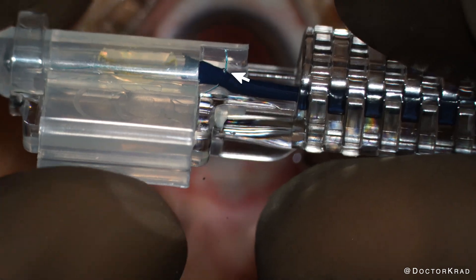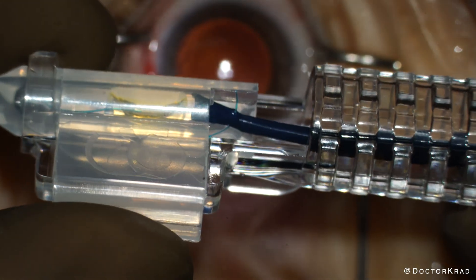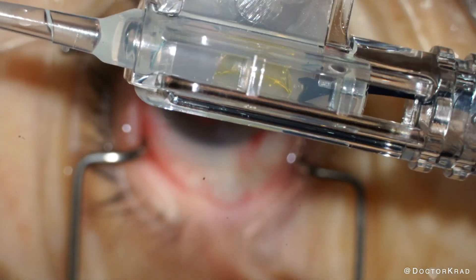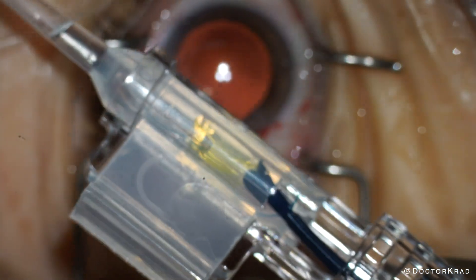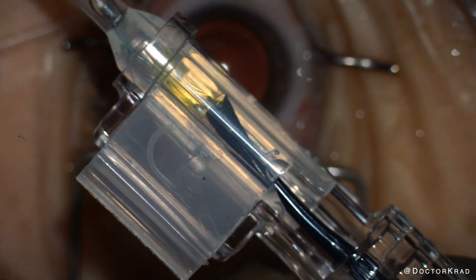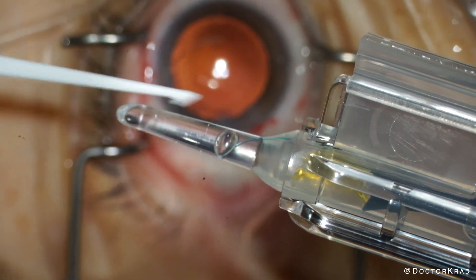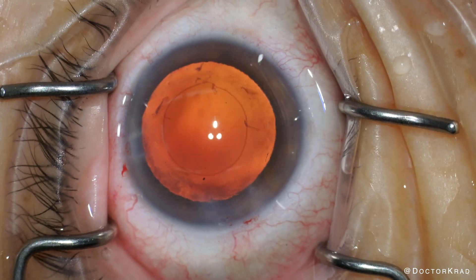For the trailing haptic, you have to make sure it's out of the way of the plunger — in this case, it's above or anterior to the plunger. Now let's inspect the lens as it's advanced through the cartridge and nozzle. The loading definitely seemed easier than the previous injector. As you can see, the lens looks good as it is being advanced. And here you would use this white plastic hook to pull the leading haptic forward, in case it was folded on itself.